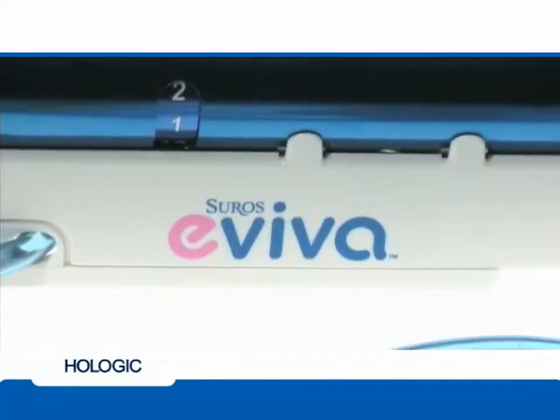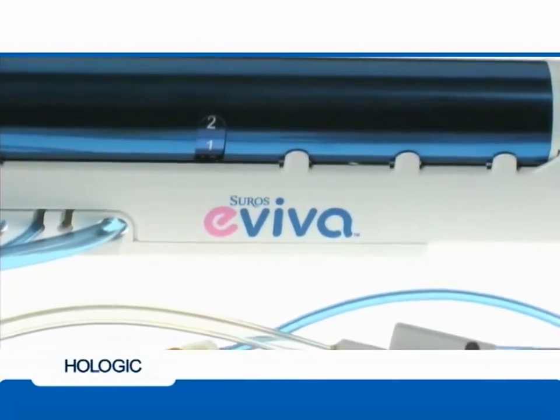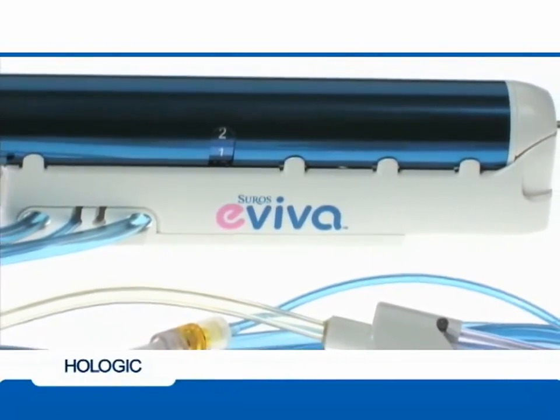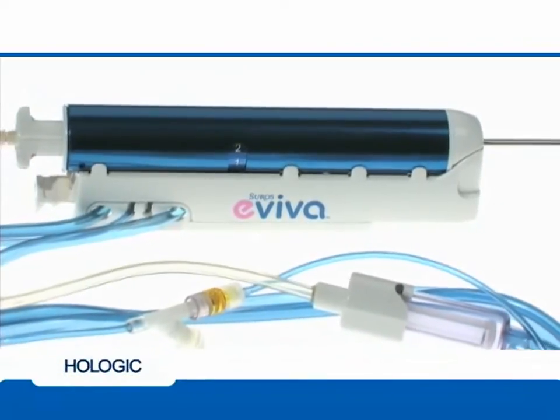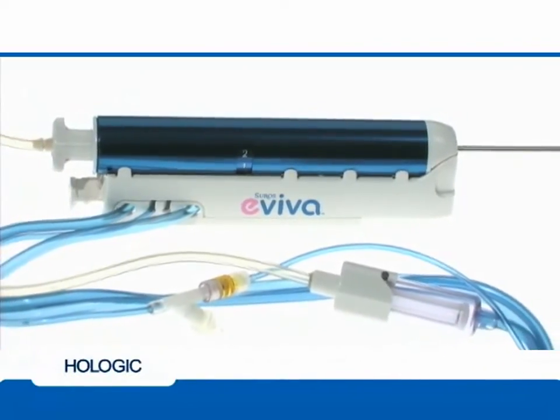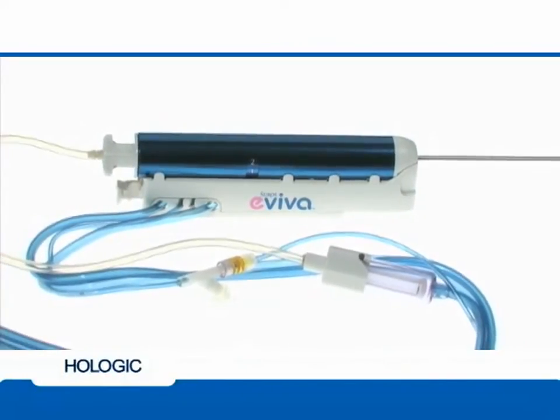The technologist takes a pair of post-fire images to ensure the center of the aperture is at the area of interest. Cores can be taken at any clock position at the discretion of the physician and depending on the location of the area of interest by rotating the rear thumb wheel. The position of the aperture opening, or clock position, is indicated by numbers located on the middle section of the device.